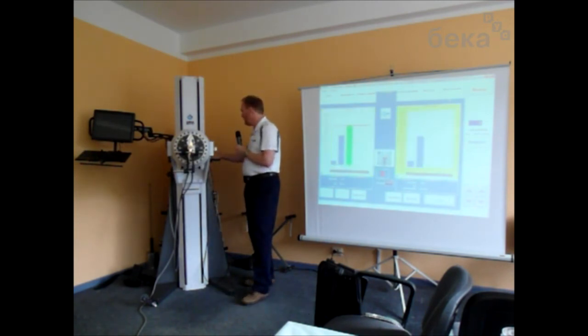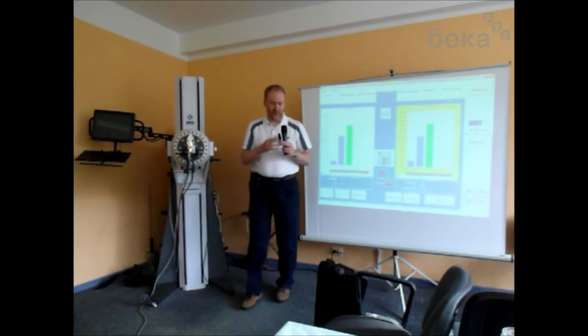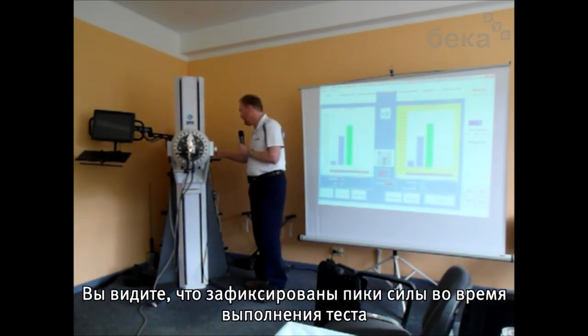And then right. So you can see it's capturing the peak value during that trial.